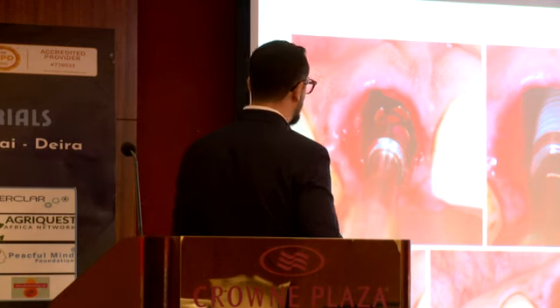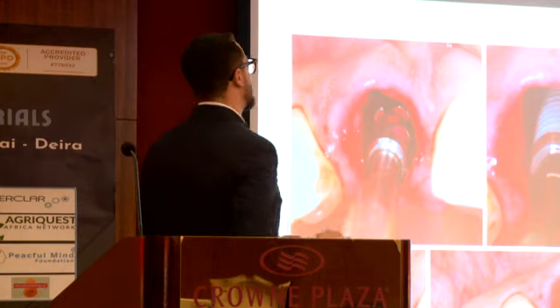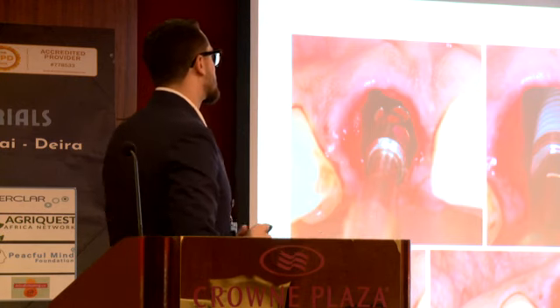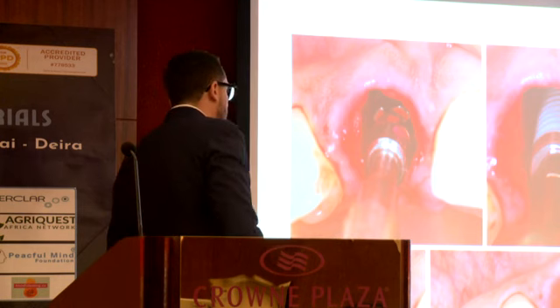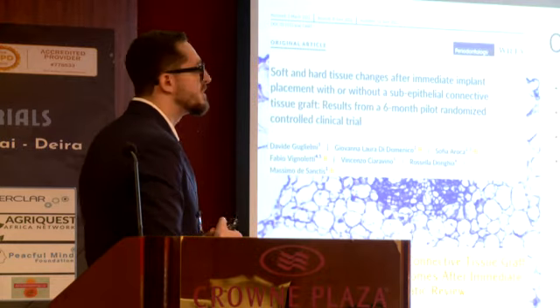So we have the implant placed on the palatal side, 2-3 millimeters in the apicocoronal dimension with respect to the free gingival margin, and where we are drilling, we're drilling against the palatal bone and the residual marginal apical bone in order to gain our primary stability. I always try to reach about 35 Newtons of primary stability, a perfect range of force in order to do our immediate restoration. Once the implant is placed, I screw in a healing cap in this phase and go to the connective tissue graft.